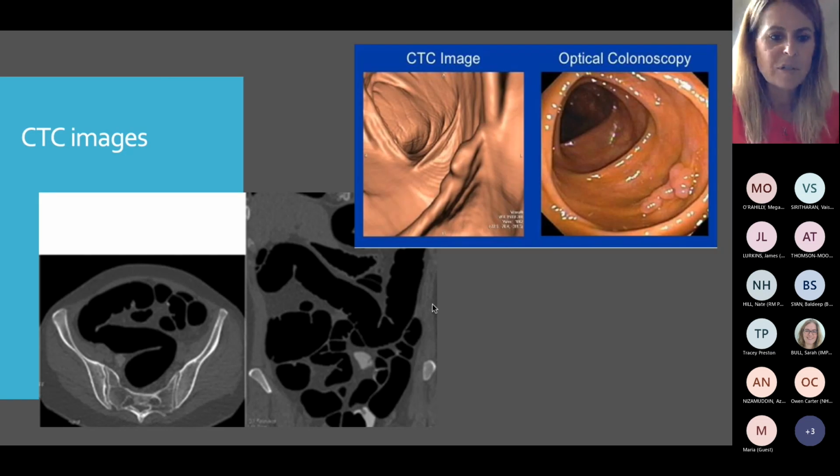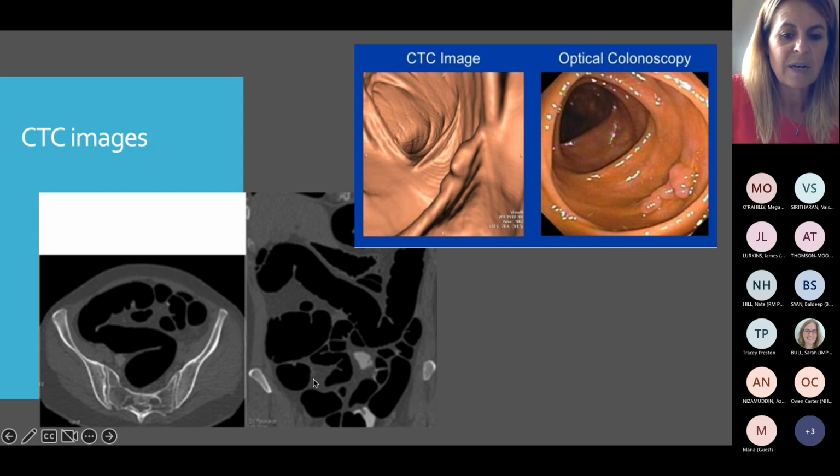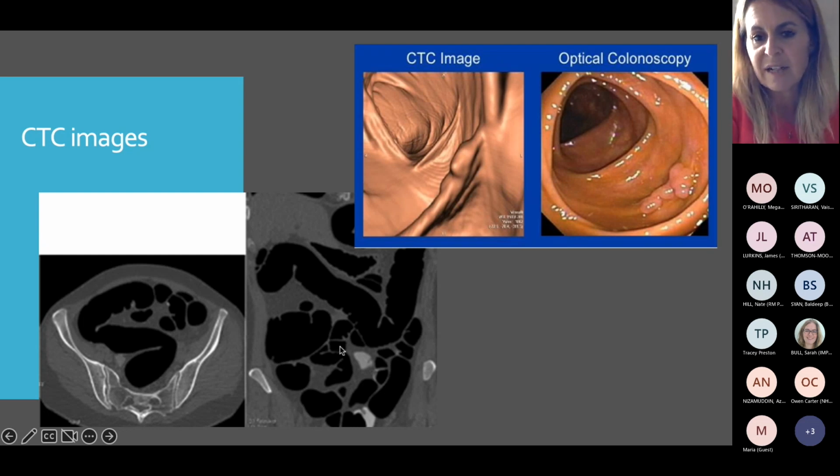So this is the kind of image that's produced. At the bottom is the standard CT image of the insufflated colon. The air within the colon is all black. And you can see some of the small bowel has also been insufflated, which you often see. These small bowel loops down here, when the ileocecal valve is a bit incompetent, you just distend everything. And sometimes you get distension all the way up the esophagus and patients burp, because their ileocecal valve is so incompetent, you've just got one open communication all the way to the mouth.